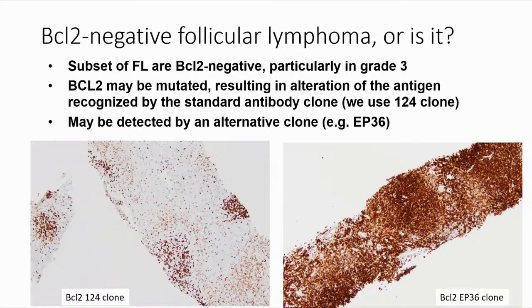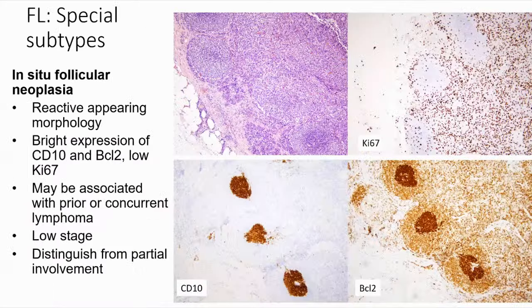Right. So for duodenal follicular lymphomas, the immunostain pattern is similar to the nodal follicular lymphomas. Is that right? Yes, it's the same. They should have a really nice classic pattern. In this one, I only showed a couple of stains. I showed CD10, and the BCL2 is a little bit brighter.